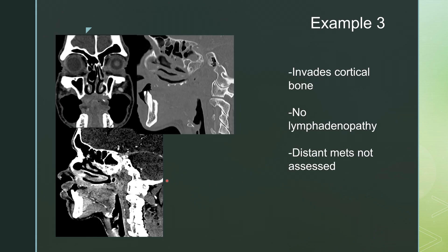Next case: a more subtle tumor. You can see soft tissue with absence of the hard palate and cortical irregularity where the bone is still there but is being eroded by this aggressive process. On the sagittal view and on bone windows, you can see absence of the hard palate anteriorly. This mass invades the cortical bone of the hard palate. On these images there is no lymphadenopathy and distant mets were not assessed. So this would stage as a T4N0MX due to invasion of the hard palate.